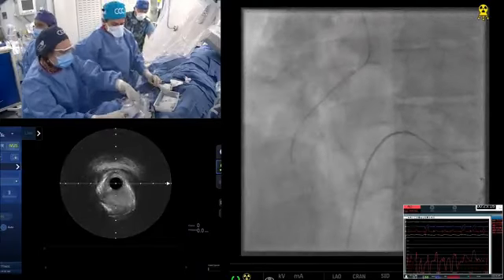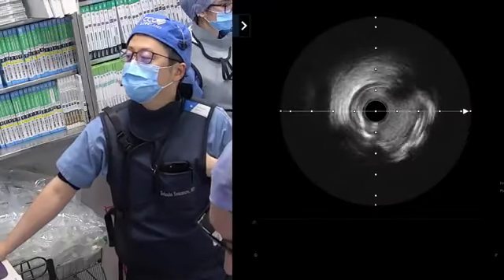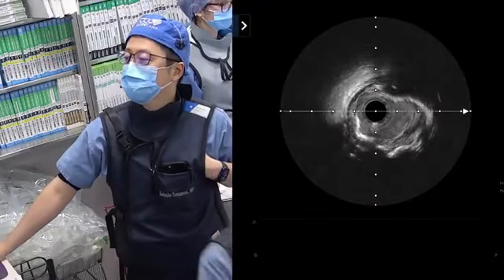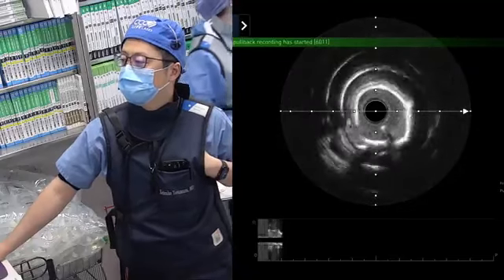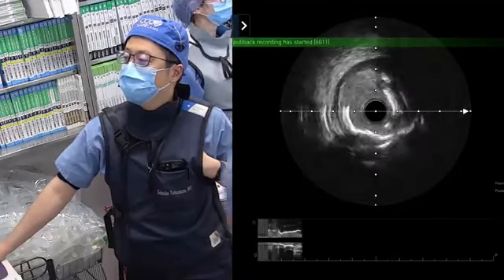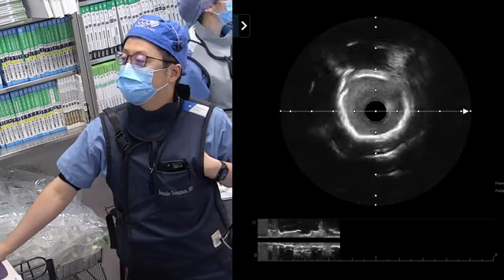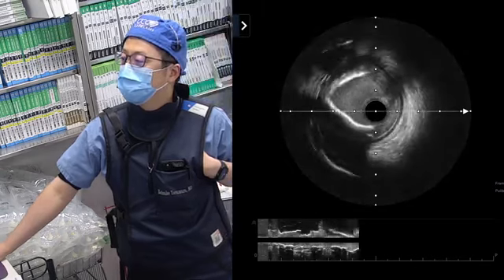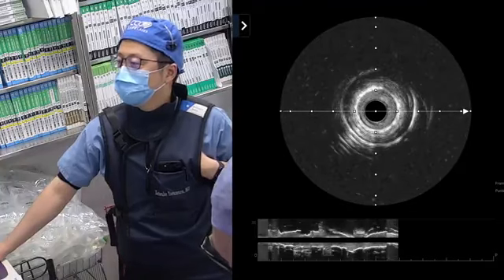Okay. Yeah, check the image. Still on the plug, but I can start from here. Yeah, coming pullback. Yeah, the lumen is definitely bigger. I see some big fractures. Calcium fracture there. Diffuse plaque. The 3020 stent.